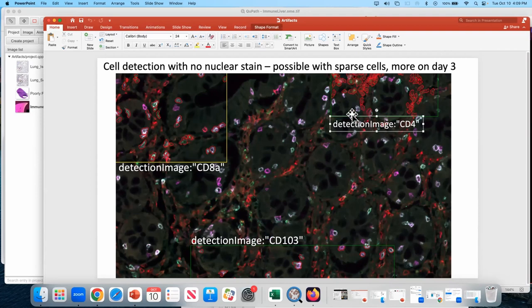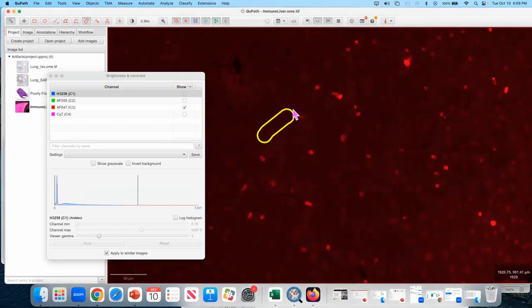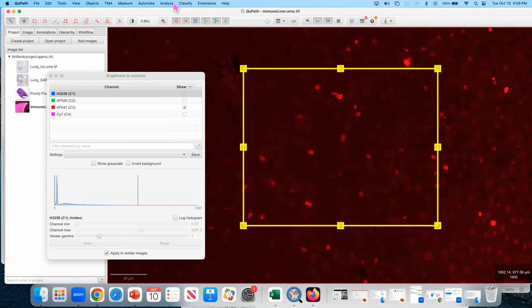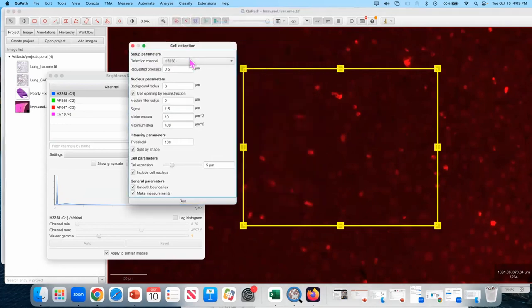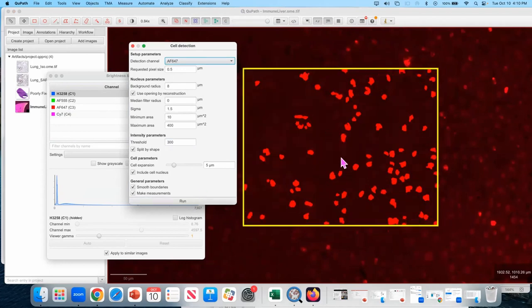And I'm just presenting to you the results of using pretty much default detection settings, just changing that detection image. So in this case, just to give you a quick example, I'll create a small annotation, and use this detection channel. Maybe increase the threshold a little bit.